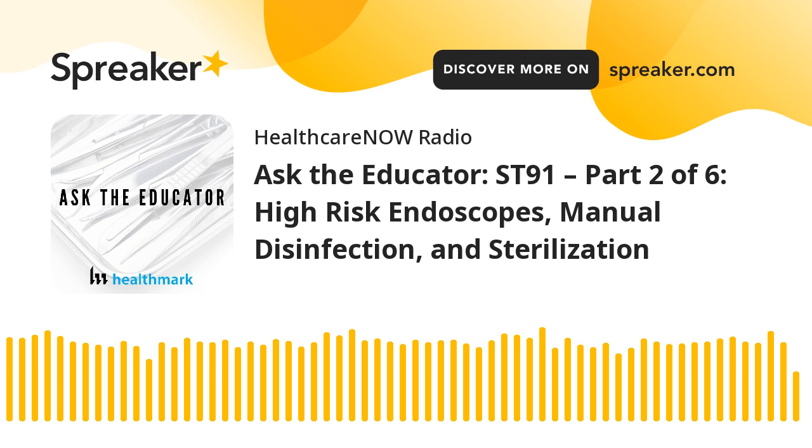They're already, and have been for many years, compatible with low temperature sterilization systems. So why aren't we sterilizing them? You get a wrapped storable item that can lay flat in that wrap for your healthcare facility policies. And it's just a higher margin of safety associated with sterilization versus high-level disinfection. So I implore you to look at your inventory and get those low-hanging fruit out. Those are also high risk. All of those were high risk scopes that I just talked about.